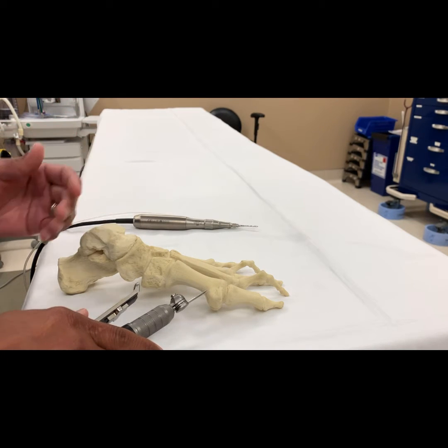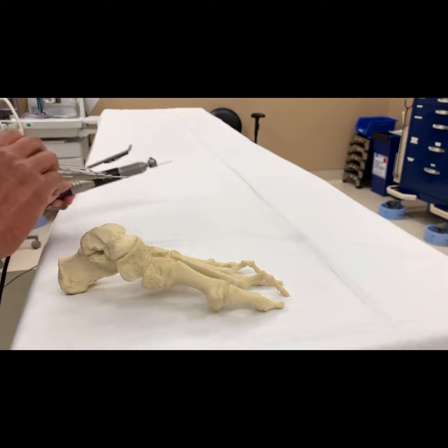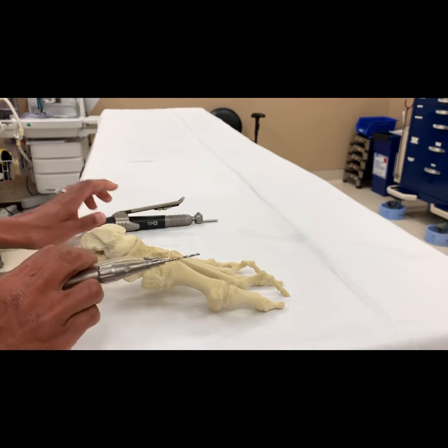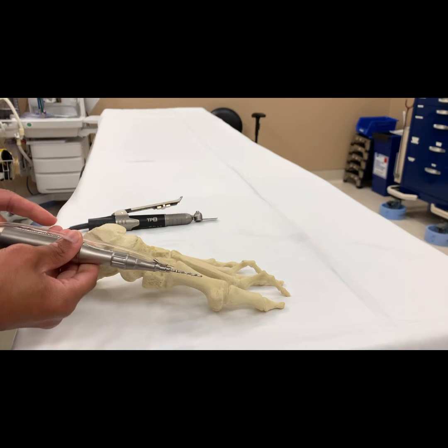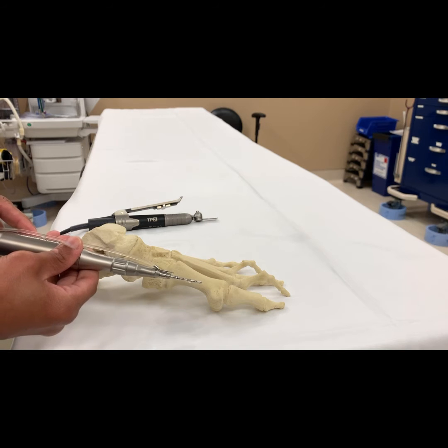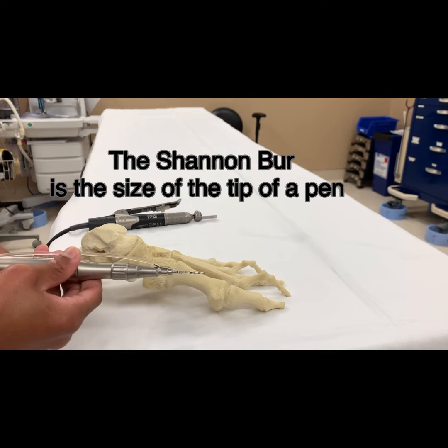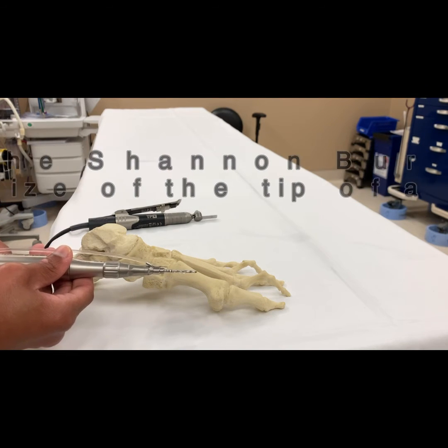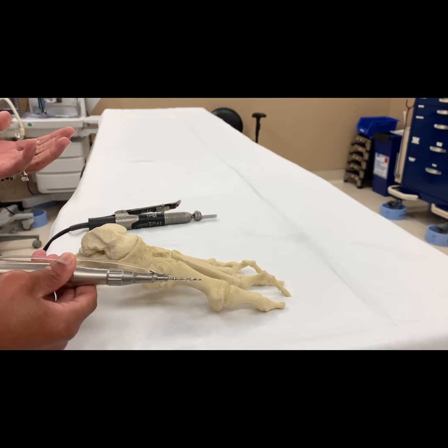But admittedly, it is a lot more exposure and a lot more soft tissue dissection than this tool at only 6,000 RPM. It tends not to cut tendon and doesn't really cut soft tissue. Clearly, if one places a lot of pressure it can happen, but it is much more respectful of the soft tissues.